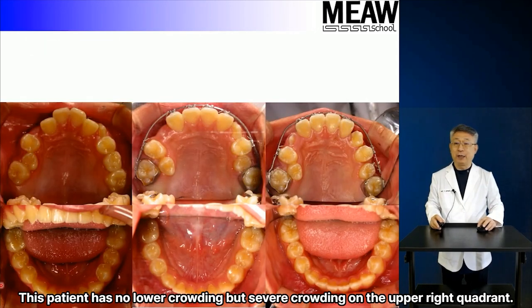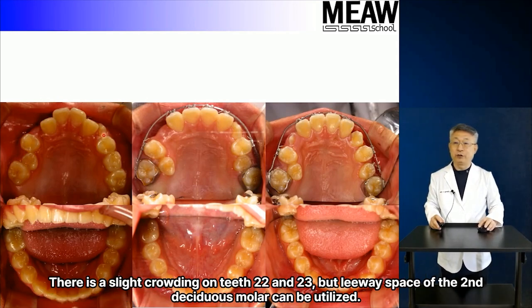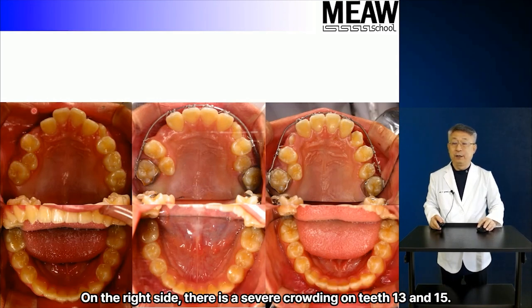This patient has no lower crowding but severe crowding on the upper right quadrant. There is a slight crowding on teeth 22 and 23, but leeway space of the second deciduous molar can be utilized. On the right side, there is a severe crowding on teeth 13 and 15.